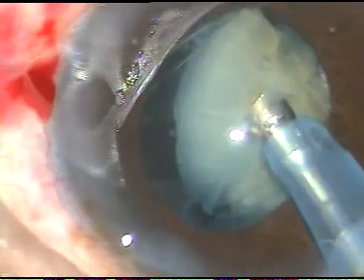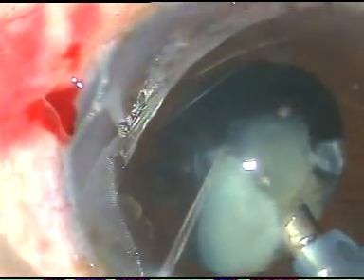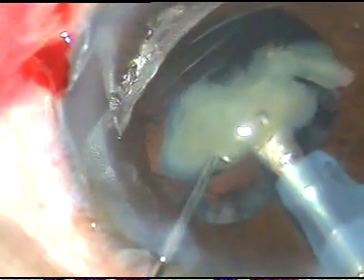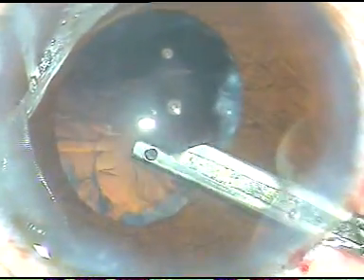This is the remaining portion of the nucleus. This is the last portion, last fragment. I remove the chopper, let the posterior capsule go little backward, and I emulsify and remove the last fragment. That's it. I have managed the nucleus in an almost can opener capsulotomy.